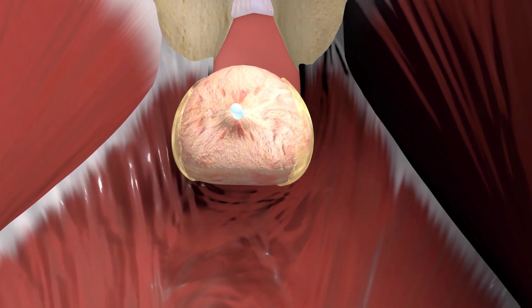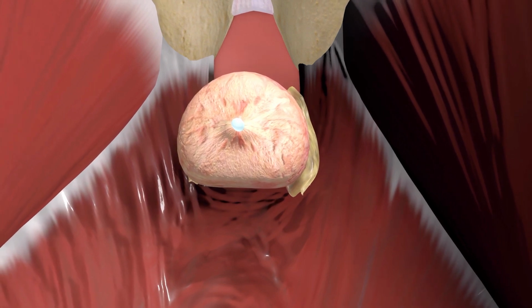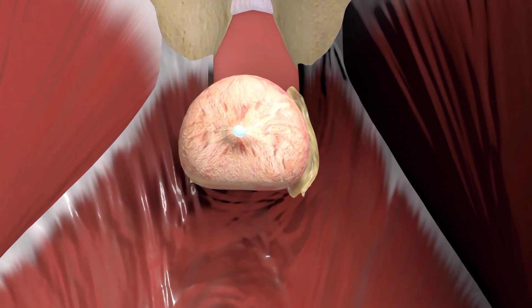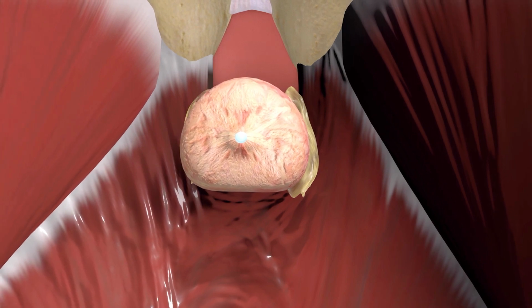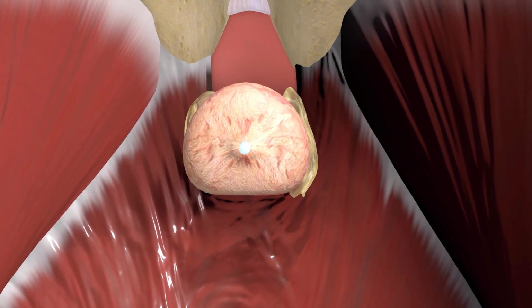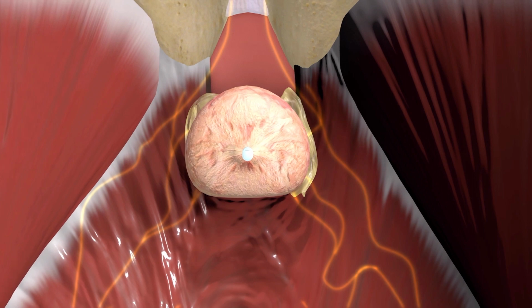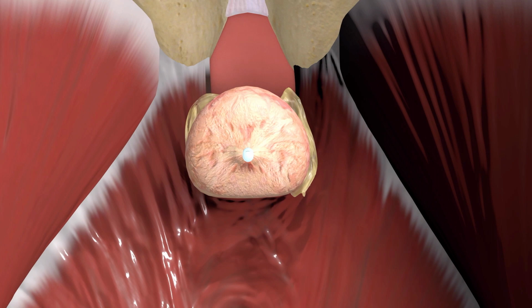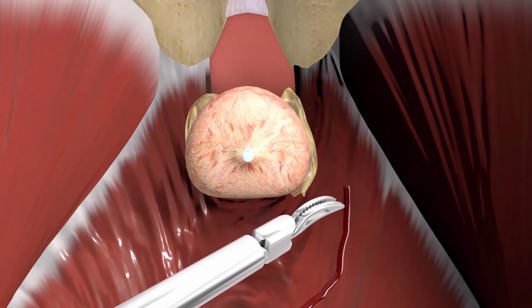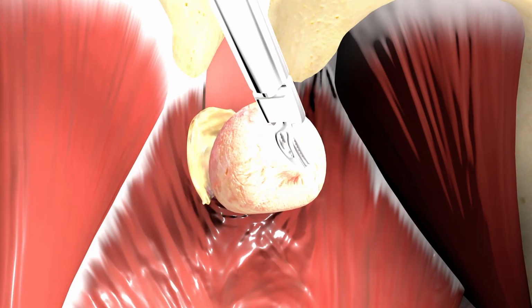When surgeons perform a nerve-sparing prostatectomy, they peel off the thin layer of tissue on the sides of the prostate. Although this procedure preserves the autonomic nerves involved in the initial phase of erectile function, it frequently does not preserve the somatic nerves, responsible for the second phase of erectile function and urinary control. At various points during the procedure, these invisible and delicate somatic nerves may be damaged due to cauterizing, cutting, or stretching.